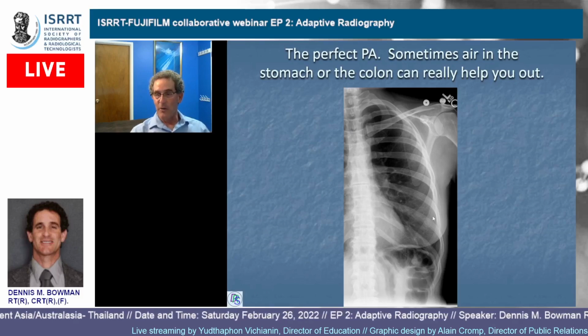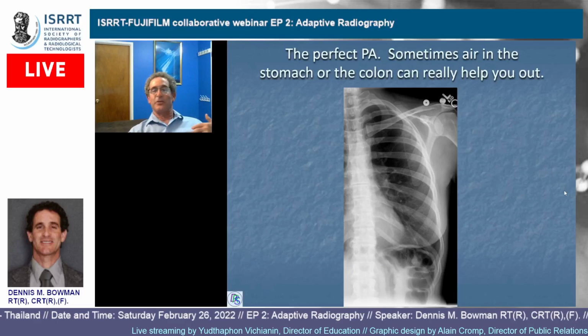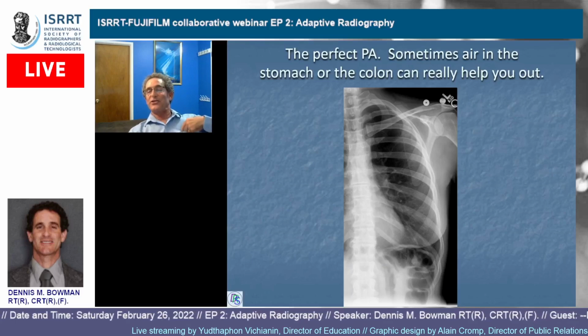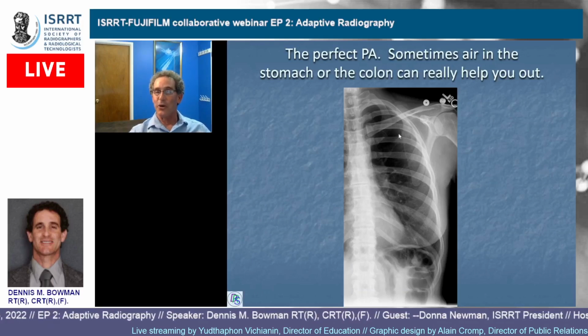So again, here are the posteriors. So let's say the person fell down, hit some coffee table or something right on these upper ribs. So way up high, up here is where they're hurting. So you go kind of right in this area. And it's obviously anteriors where they're hurting.